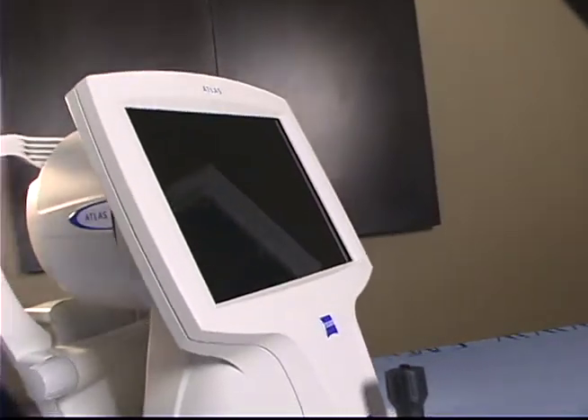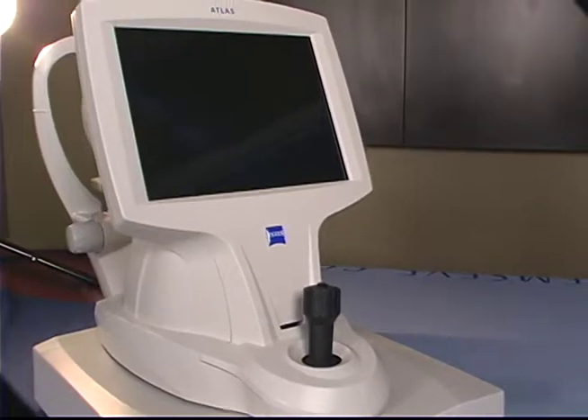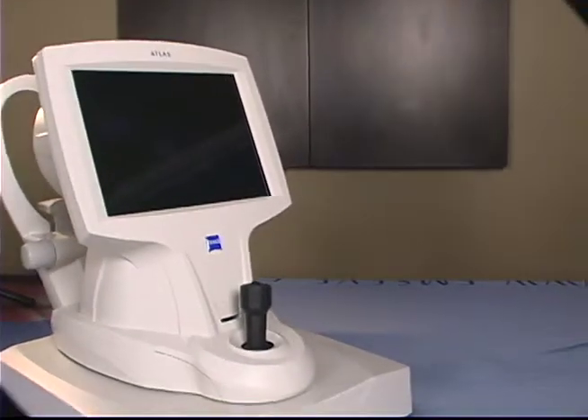If fitting rigid gas perm contact lens, the MasterFit module is a great asset to minimize fitting time and maximize patient satisfaction.